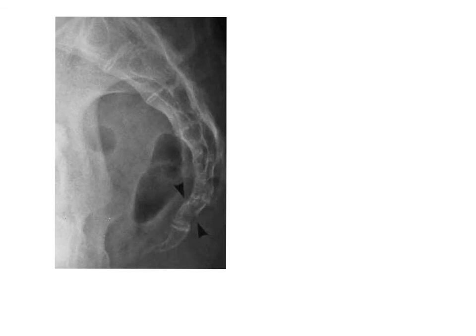All right, here is our lateral sacrum and coccyx. We automatically know that this is not a passable image because we do not have our lead marker. But we also do not have, and what should always be included is, the L5-S1 intervertebral disc space, which is missing, and a little bit of the L5 vertebral body. Think of it almost like an L5-S1 spot projection. So we must include that for it to be an acceptable image.